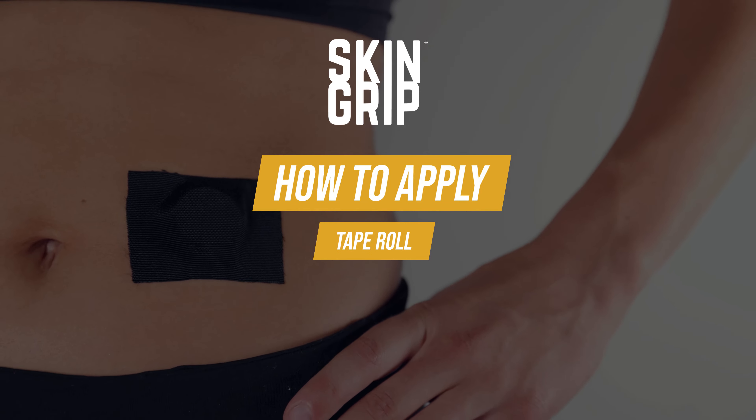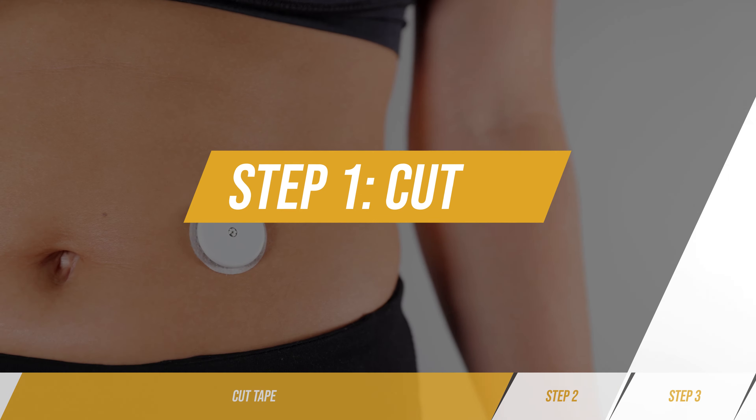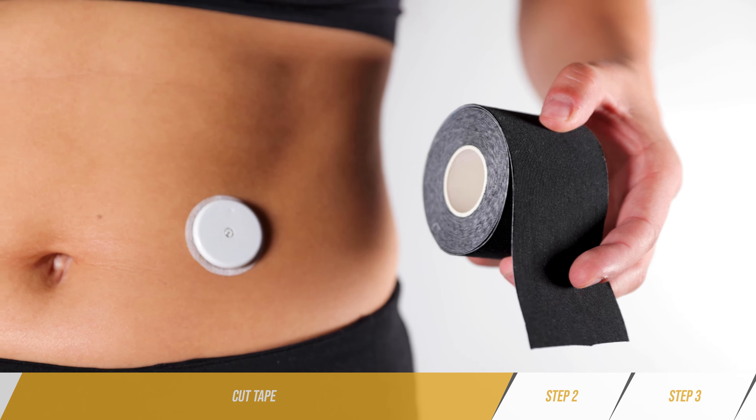How to use your skin grip tape roll. Step one: cut tape. Using scissors, cut a piece of tape from the roll. You can cut it in whatever shape or size you'd like.